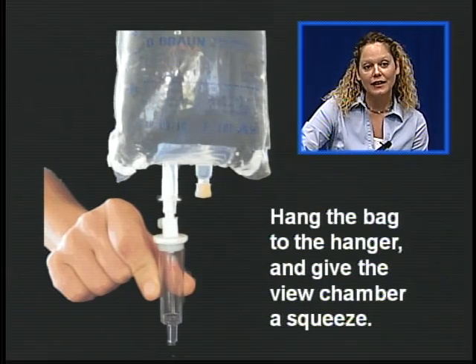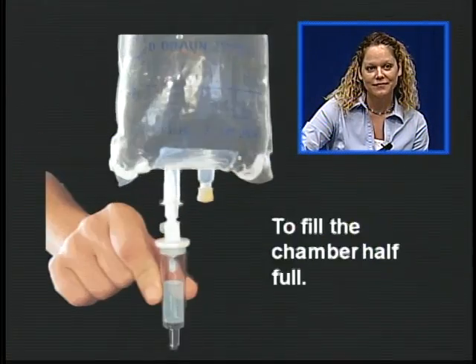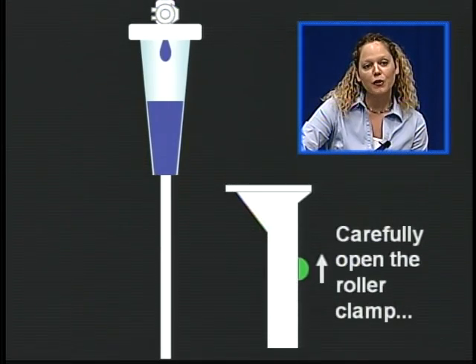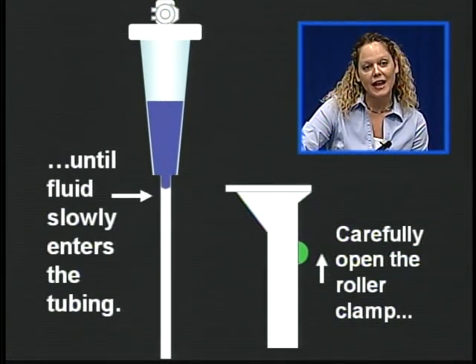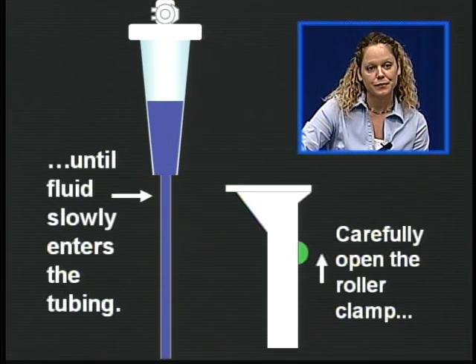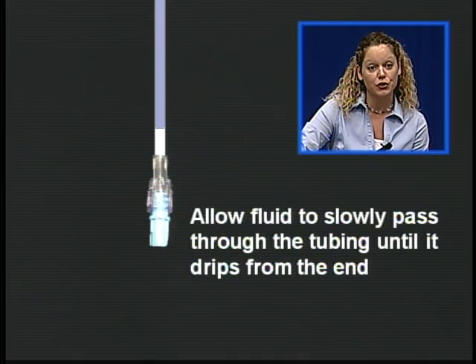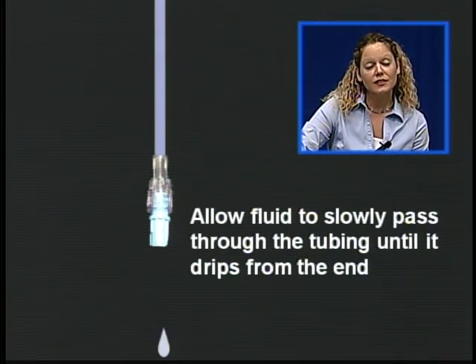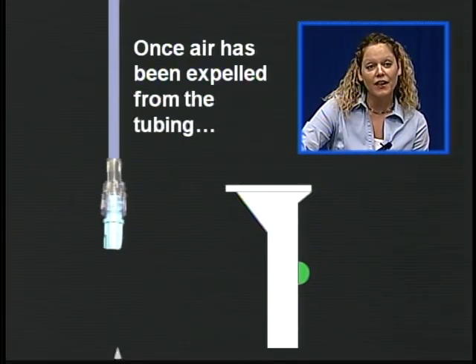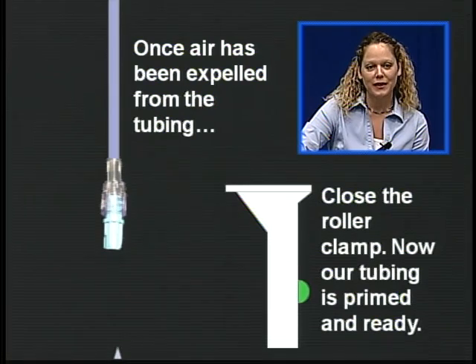Hang the bag on the hanger and give the drip chamber a squeeze — one squeeze is all it takes to fill the chamber half full. Carefully open the roller clamp until the fluid enters the tubing. Allow the fluid to slowly prime the IV tubing until it drips from the end. Be sure to purge all air bubbles from the tubing. Once all the air has been expelled, close the roller clamp. Now our tubing is primed and ready.